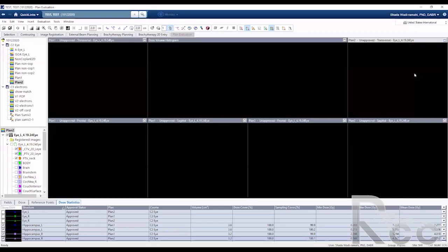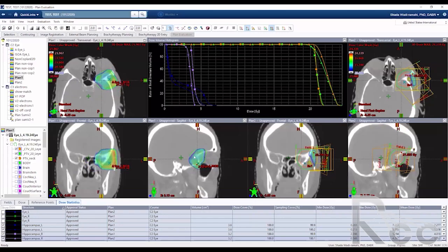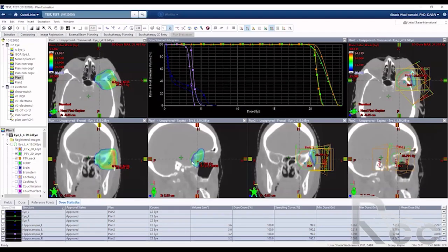You have a conformal plan down to the 50% isodose line, as well as with the MLCs and field in field, you can remove this hotspot over here. So having a hotspot is manageable, right? Because then I have solutions for the hotspot. But having the spread of doses over here, whether it is the 50% spread or having a continuous and consistent coverage where this entire strip of PTV is being underdosed, that's a problem.